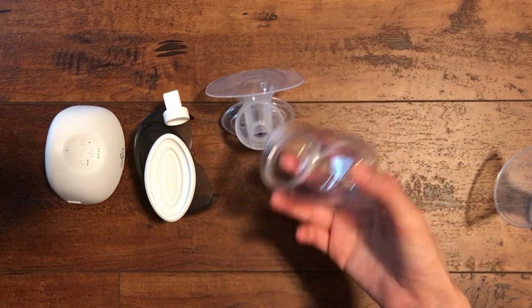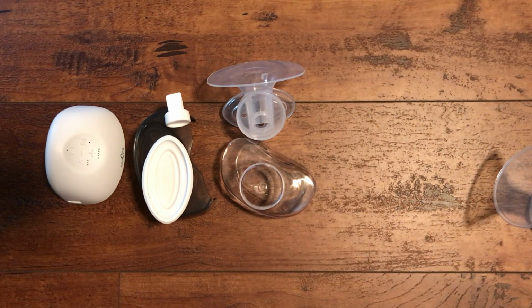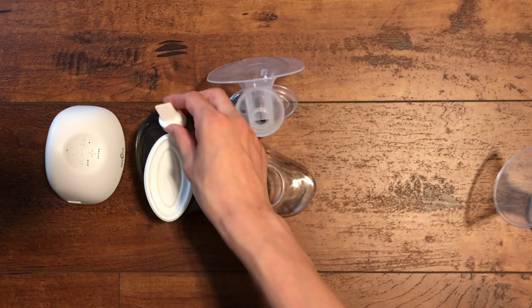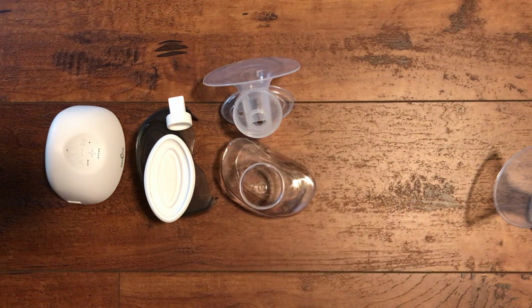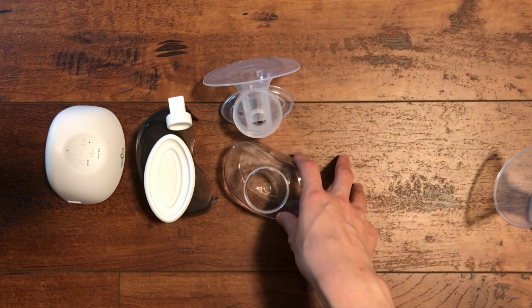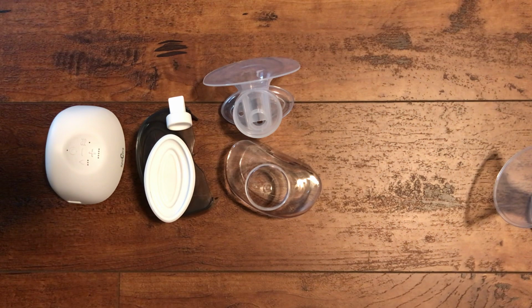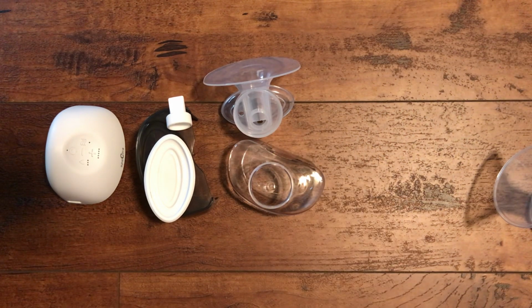So definitely do that. And then I usually just wash everything in Dapple soap, dish soap that's safe for babies. I don't really sterilize every time because I don't think that's necessary. If you sterilize every time, it might shorten the lifespan of these parts, and these parts are very hard to get in the United States right now. So I just wash them thoroughly and dry them well. I did sterilize it initially when I took them out of the box, but that's about it. So that's how I've been cleaning it.